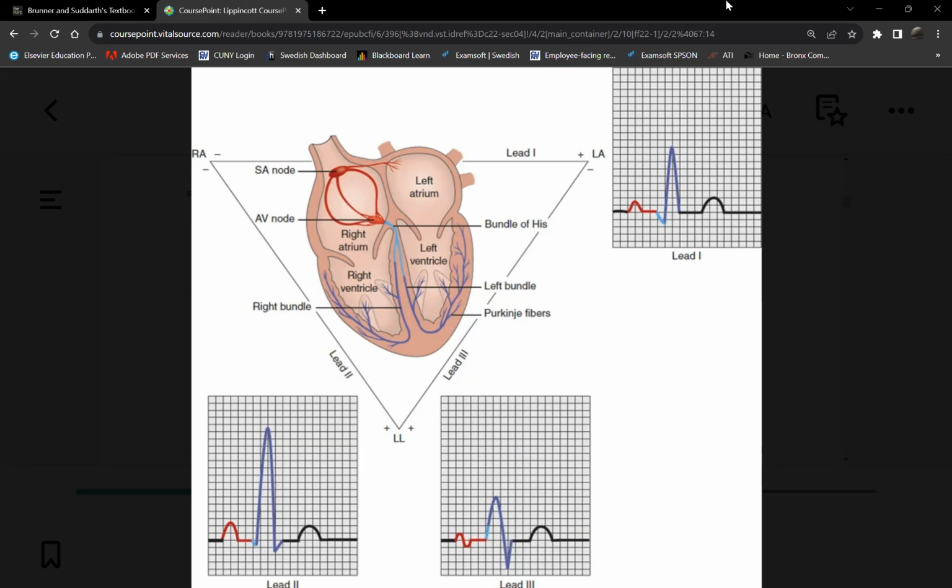All right. So when we say 12-lead ECG, which is the minimum standard in order to make a diagnosis of an abnormal heart rhythm, this is different from what you see in telemetry floors. So who works in hospitals here? All right, so have you seen patients on a cardiac monitor? Yeah.